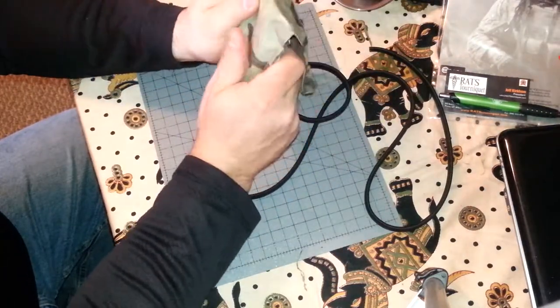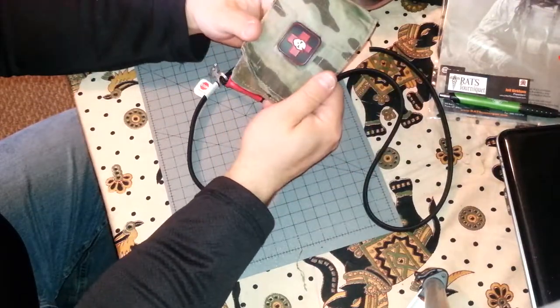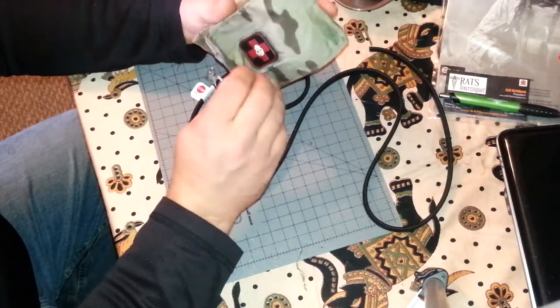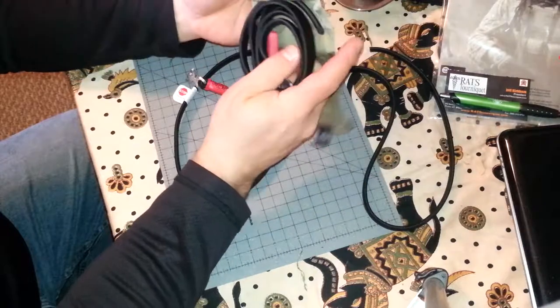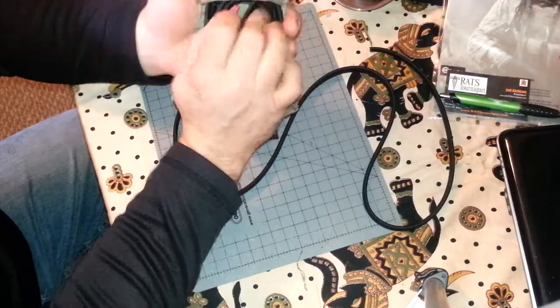This is the ITS slimline pouch, made specifically for medical gear. I cut off the MOLLE attachment for a belt, but that's where I'm putting my other RATS tourniquet. It's working pretty well so far, but it's a little bulky — I can feel it in my back pocket, so I need to figure something else out.